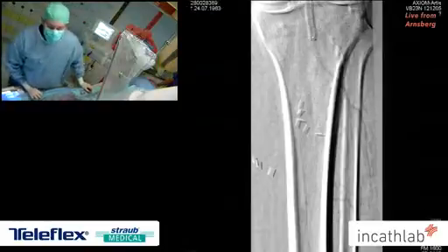You see the outflow now, which we think was quite efficient for this patient. And what I can tell you, this morning we followed this patient and did an ultrasound. There's still a very good inflow in the tibial artery. So I think this patient has a very good option now for training, and we will keep him, of course, under control for the next months.